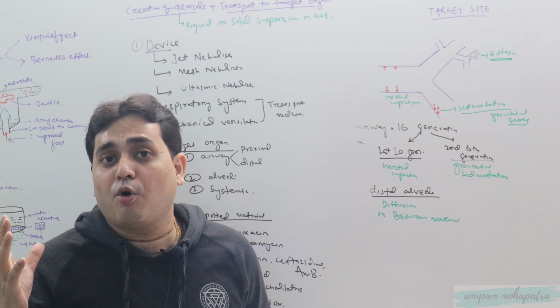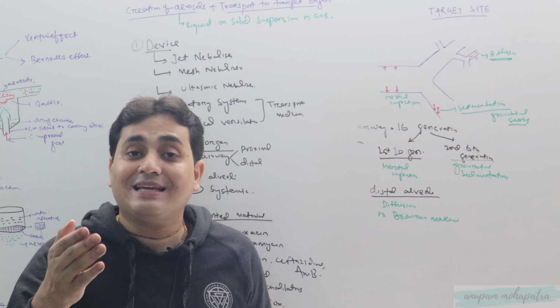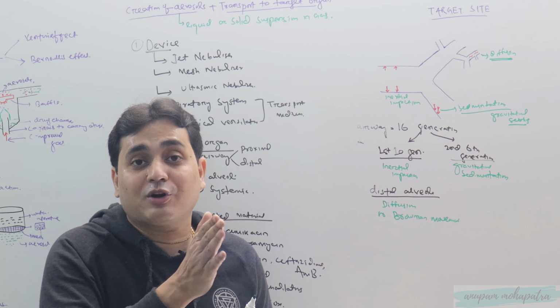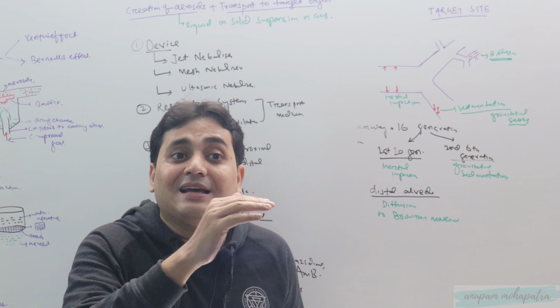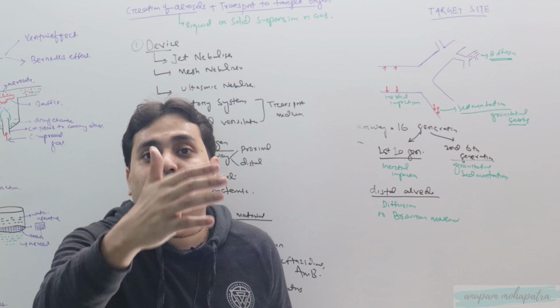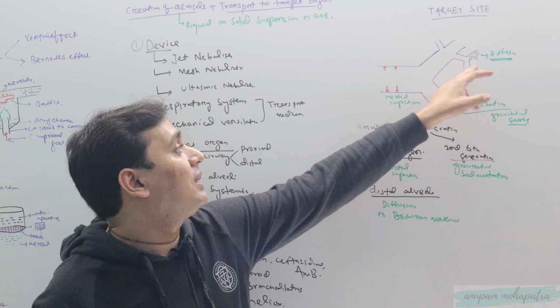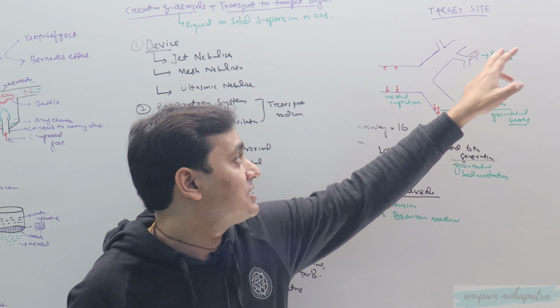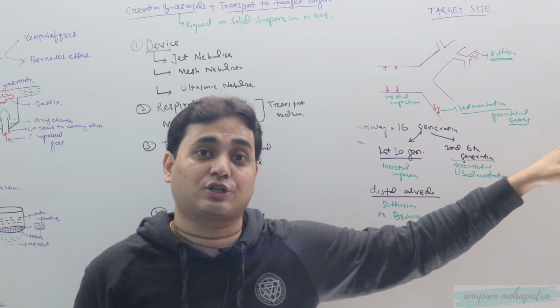Just imagine for a moment you are lighting incense stick, right? When the incense stick is lighted, the smoke will travel. You can see the smoke traveling around. This is the diffusion or Brownian movement. So the fragrance get reached to a distance location, right? In the same way, it is the diffusion that will carry the aerosol to the alveoli. So this is the major mechanism. So how to maintain this diffusion we'll discuss in our next class.